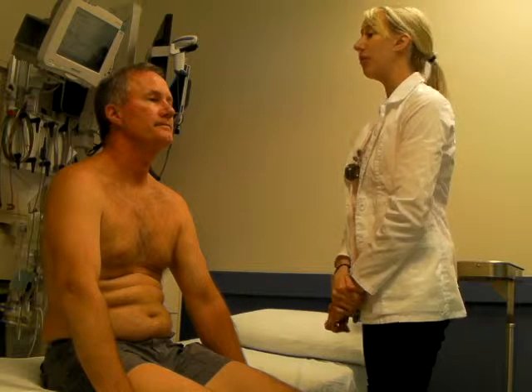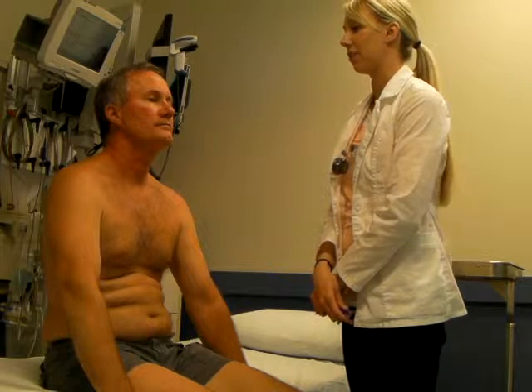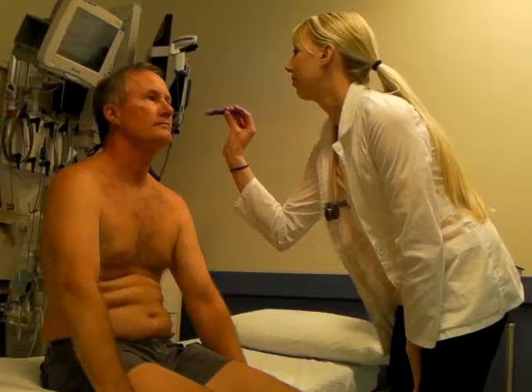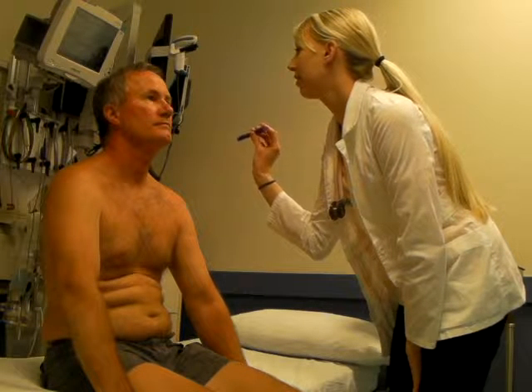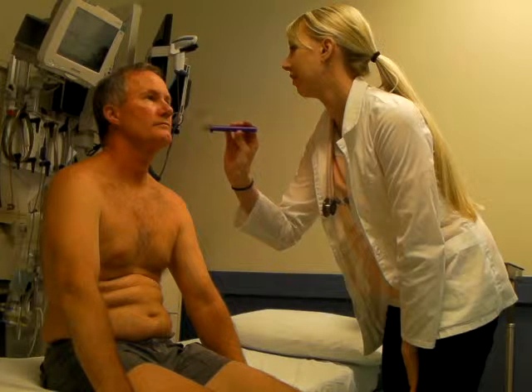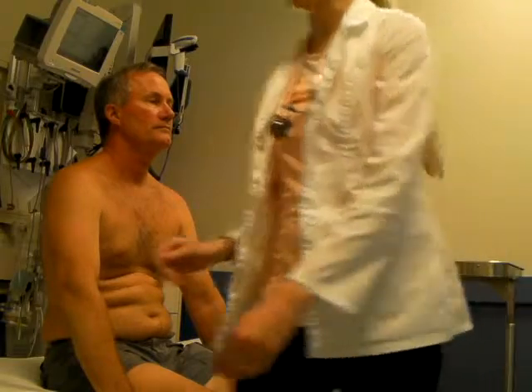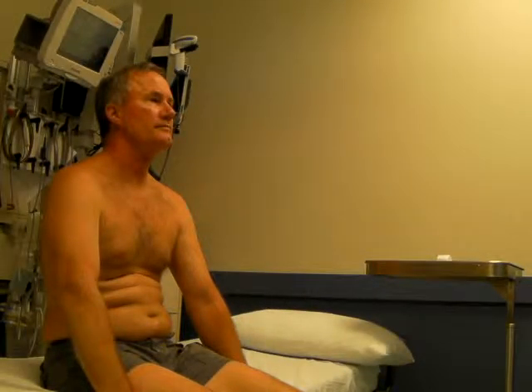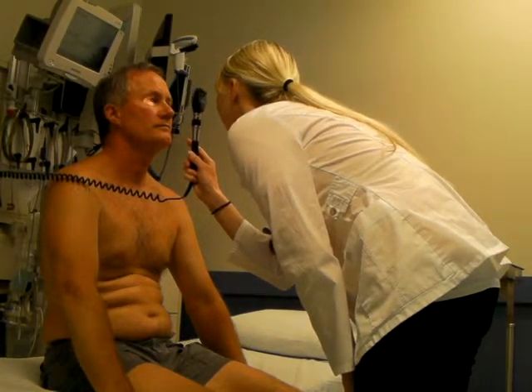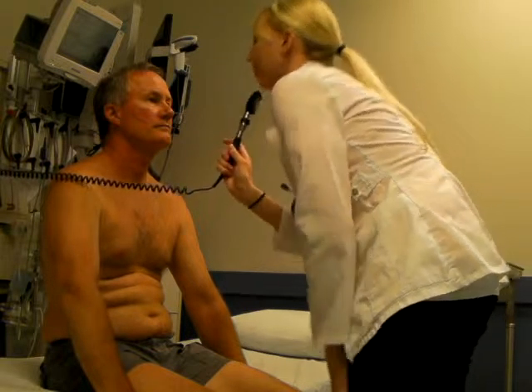Next, I am going to ensure that his pupils are equal and reactive to light, both directly and consensually, by having him pick a spot on the wall to look at. And I am going to note direct, consensual, direct, consensual. Great. After this, I am going to elicit the red reflex with the ophthalmoscope. Great.